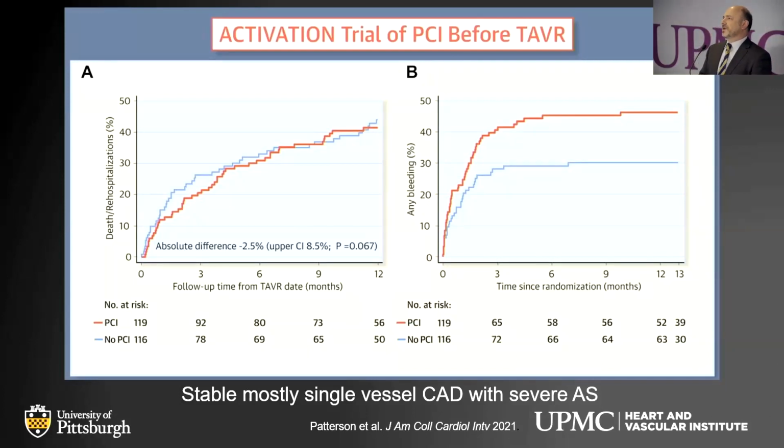This is a European trial looking at PCI before TAVR in patients with mostly single-vessel, stable disease. And as you can see in panel A, there is complete overlap of the curves. In fact, this trial was terminated early. No difference in events, but there is a difference in the bleeding rate, which is higher in the patients who underwent PCI, as you'd expect, because of the dual antiplatelet therapy.